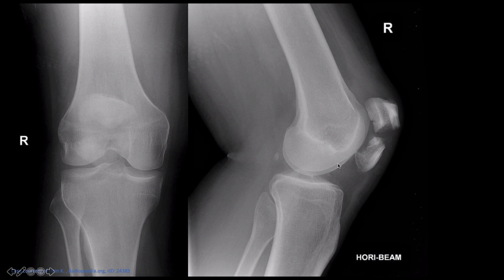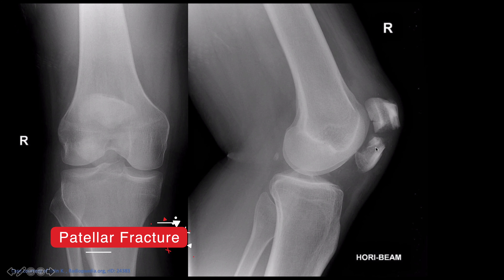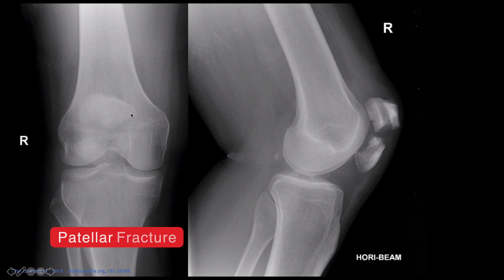In this next case there's an obvious fracture of the patella. You can see how the superior and inferior pole traction from the quadriceps tendon and the patellar tendon causes displacement, visible on the AP radiograph as well.